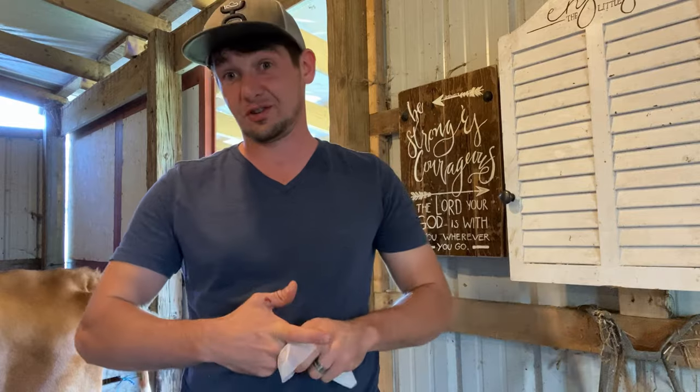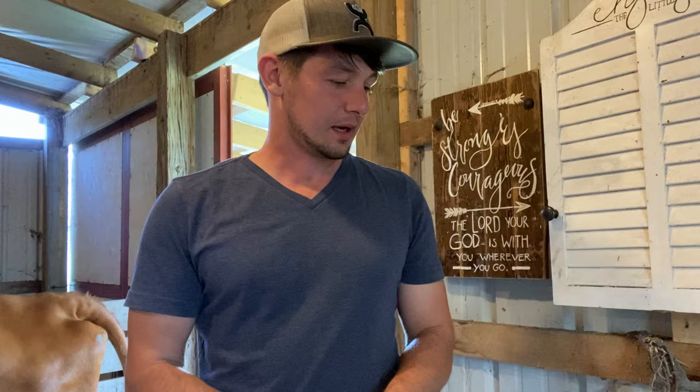That was really simple. Our first cow — the first time I did that — I had to try a few times to get that artery and it was not fun. But that went really well. Got enough blood with that one try. We'll take it in tomorrow and then they'll get a good result by the next day.